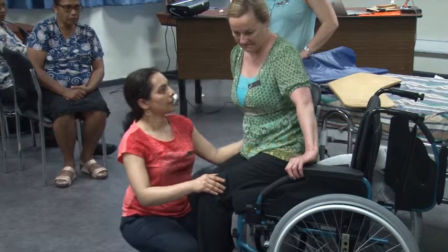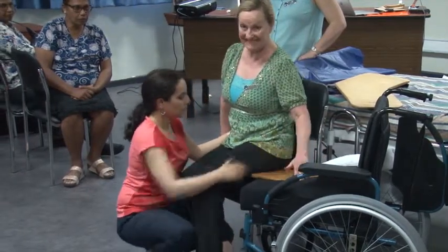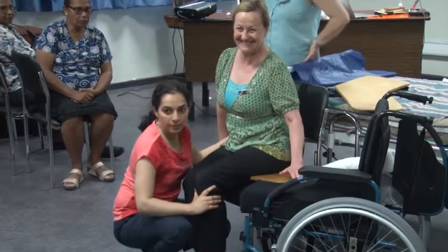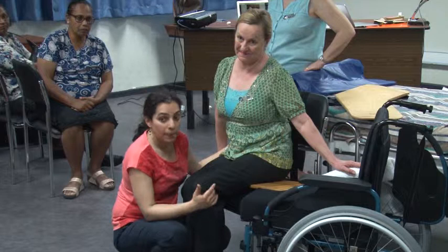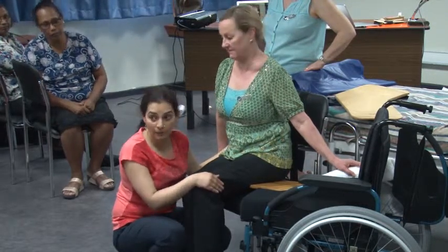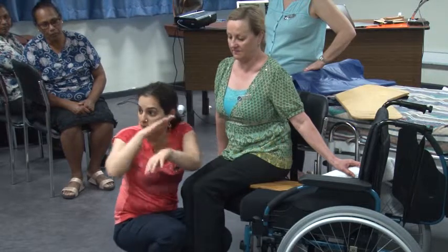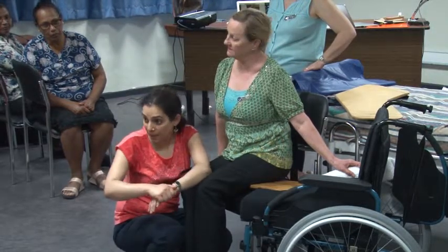Push. And so I am guiding, but you have to be careful again. If the patient is not wearing clothes, what are you going to do? Friction, right? So those are the things to bear in mind.